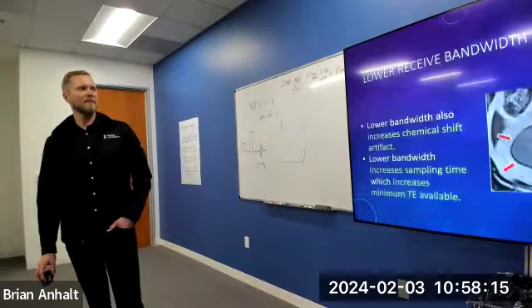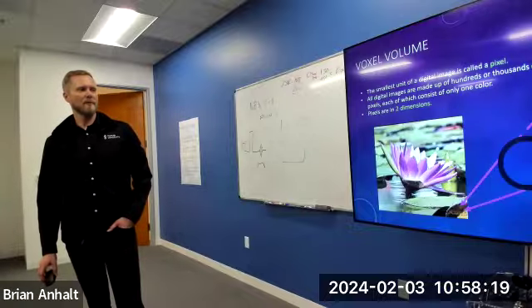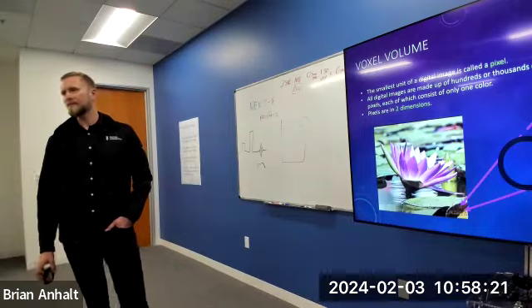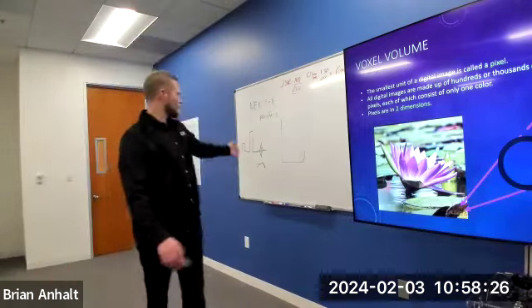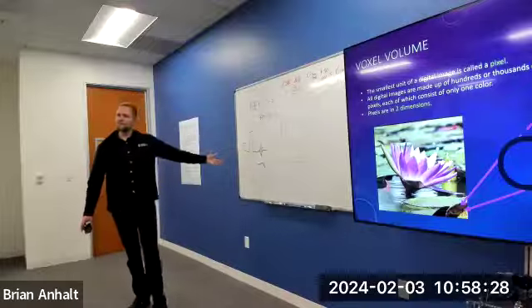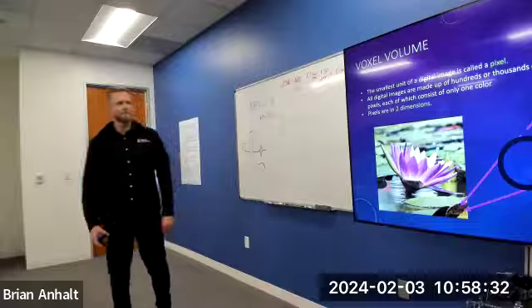Guys good with receiver bandwidth? Remember, bandwidth is just a range of frequencies. Collecting a range of frequencies is done during echo collection by putting on a gradient to give us a range of frequencies.